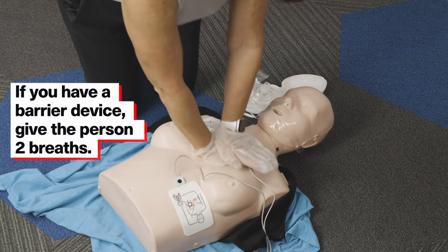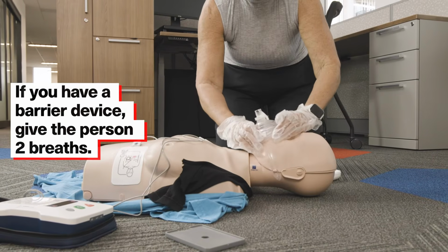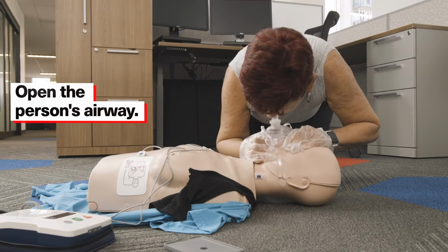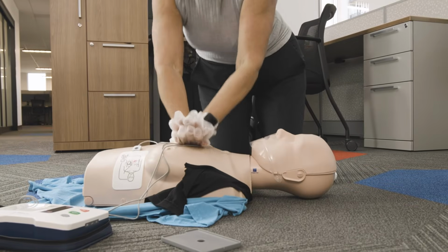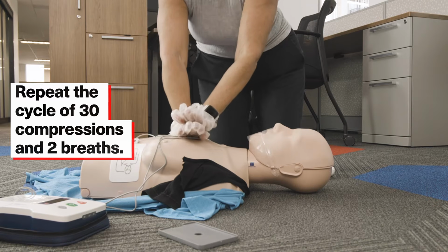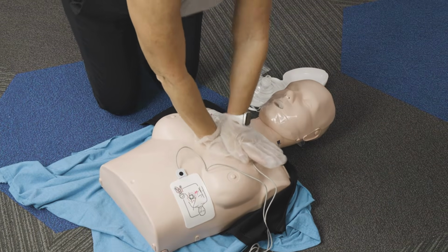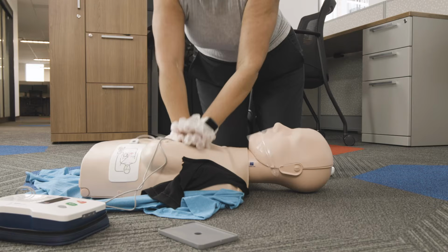If you have a barrier device, give the person 2 breaths. Open the person's airway by gently tilting their head back until their chin is pointing up. Use just enough air to make the person's chest rise. Repeat the cycle of 30 compressions and 2 breaths until emergency personnel or another person takes over, you are too tired to continue, the scene becomes unsafe, or you notice an obvious sign of life.